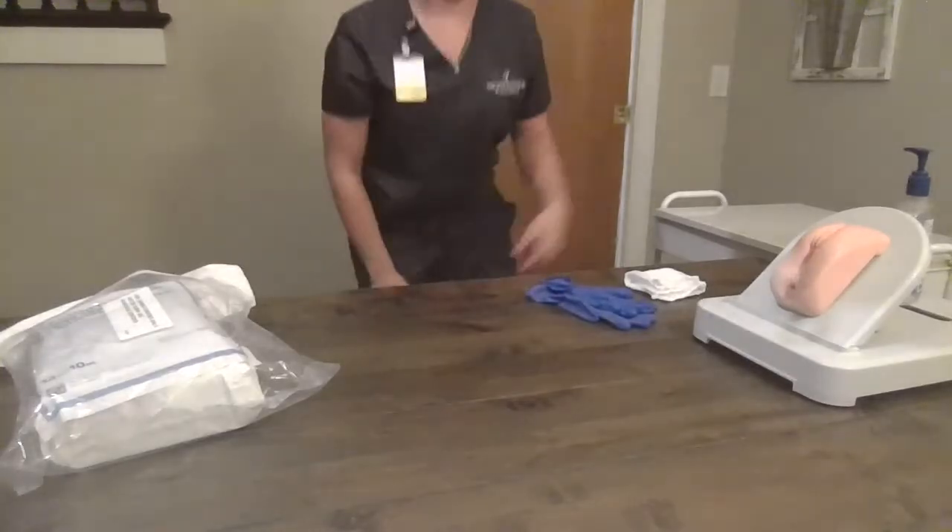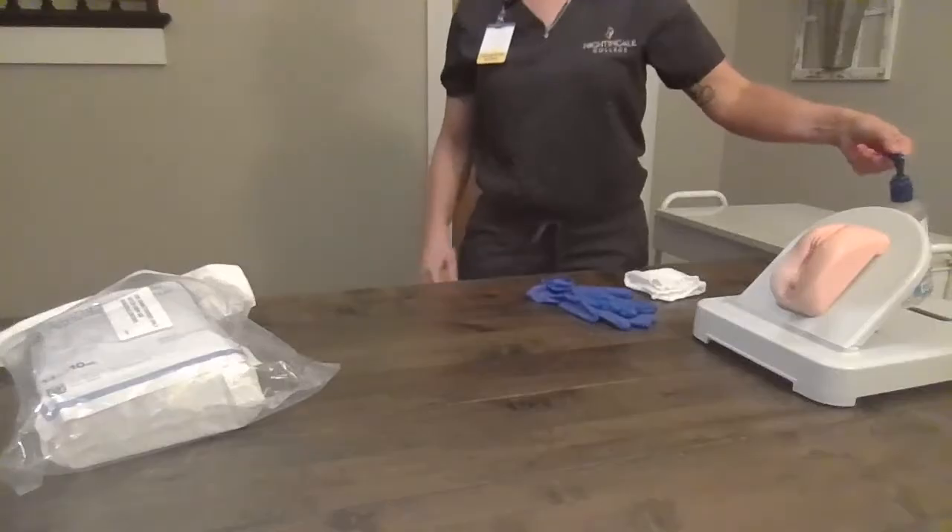Hi, I'm Kimberly Trion, and I'm going to do the female Foley catheter insertion. I'm going to enter my patient's room, close the door curtain for privacy, and perform hand hygiene.